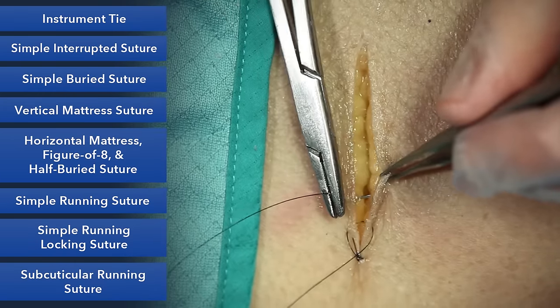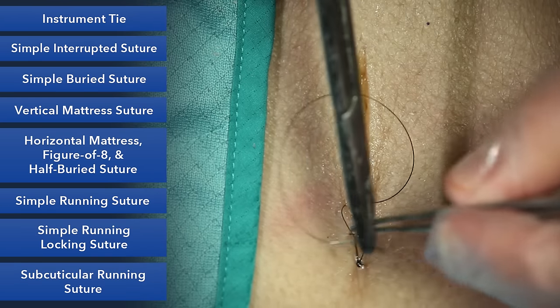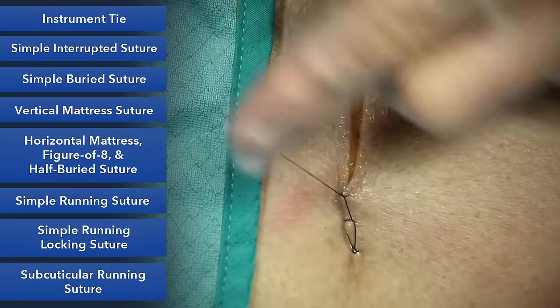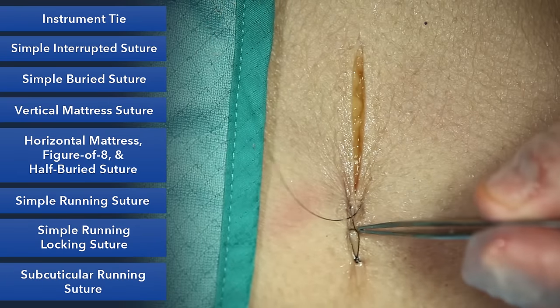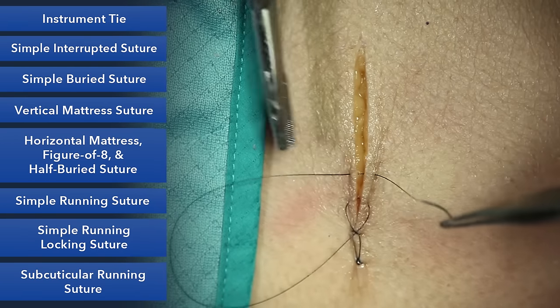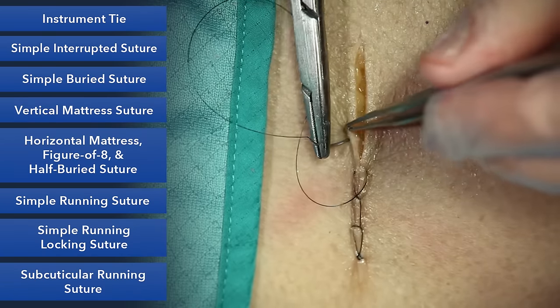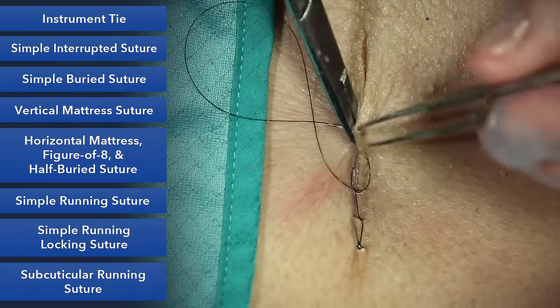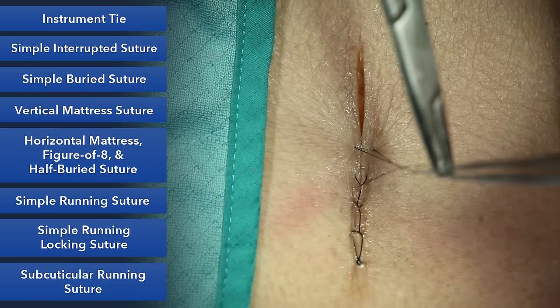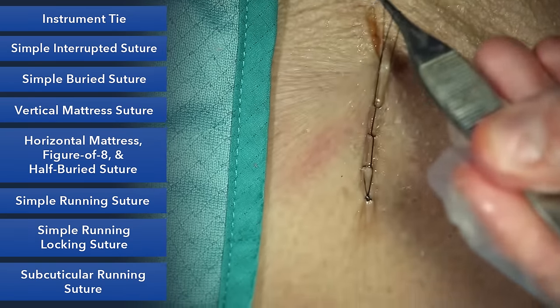And take your simple bite and simple bite, and again, before pulling up the last little bit, you'll lock your suture. And you can go on from here. And the beauty of this is that you see, although it's loose here, it is locking back here. And so when you're under a lot of tension, especially, it'll hold for itself. Now, sometimes I'll do a running stitch, and I don't plan on doing a running locking, but at some point in the middle of the suture, it starts loosening on me. And then you can just throw in one of these locking sutures. Always keep it nice and tight.